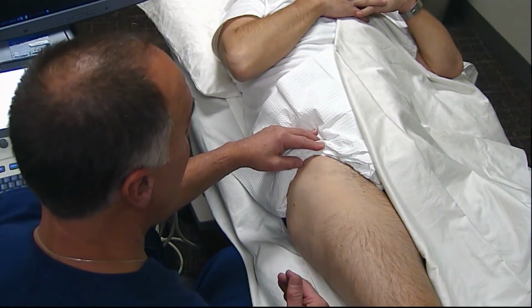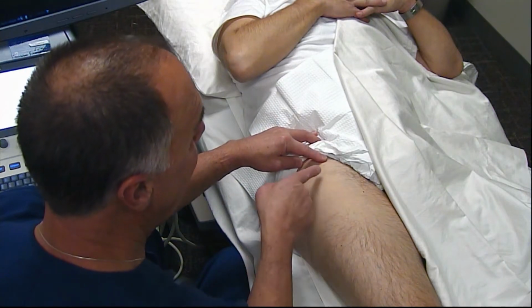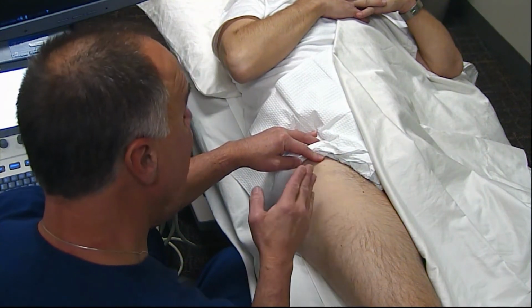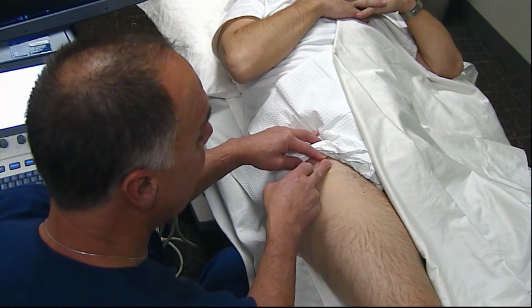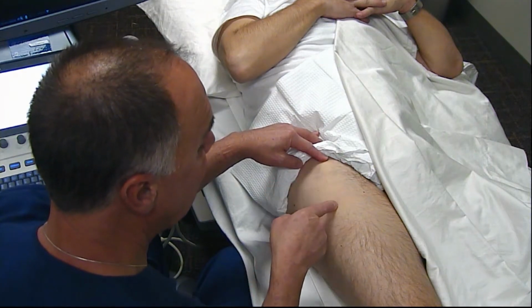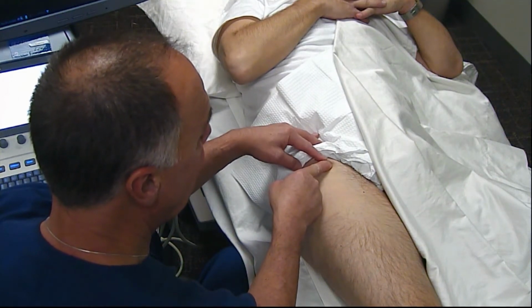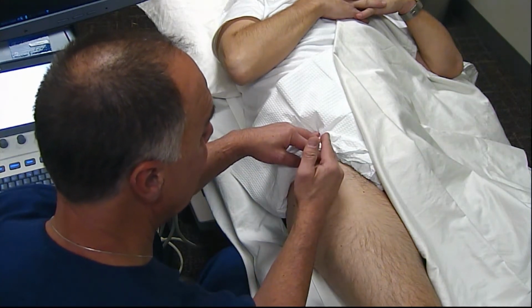Prior to starting the sonographic evaluation of the hip, I find it useful to palpate certain bone landmarks to know where to place my transducer. Not on everybody can you actually palpate the anterior inferior iliac spine, but it's important, if capable, to feel for the bone anatomy and then draw a line to the external part of the thigh. So putting my finger onto the ilium here, I can actually feel the bone landmark, and that's going to be an important part to where I start to place my transducer.